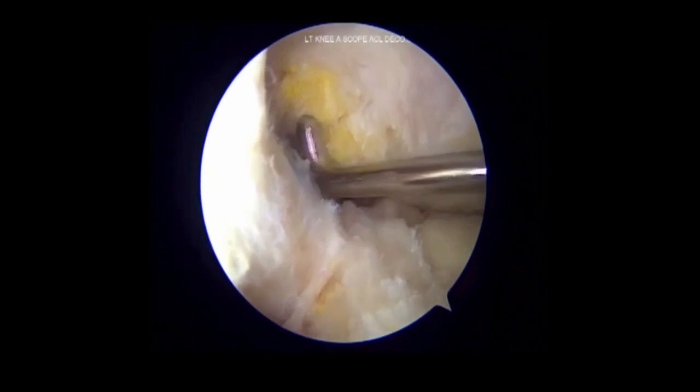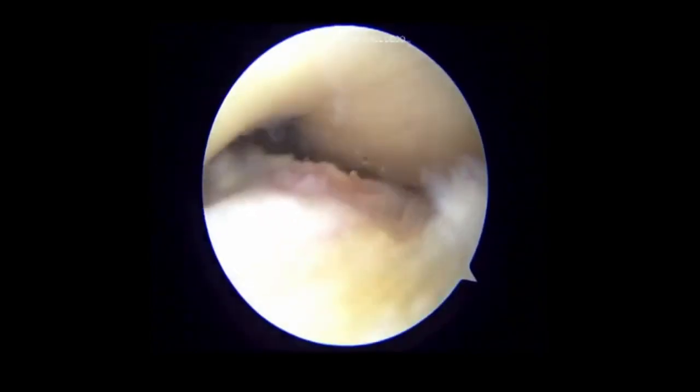The knee is then moved into extension to exclude notch impingement to conclude the procedure.